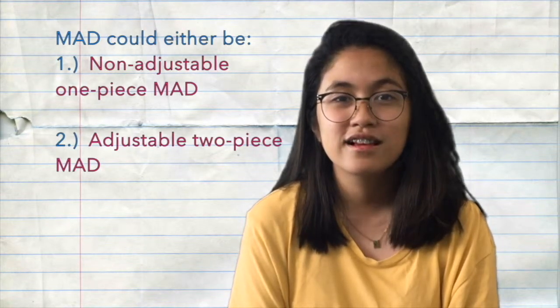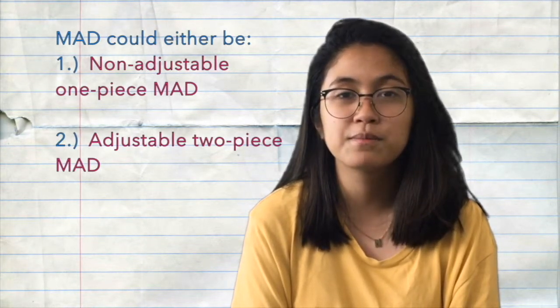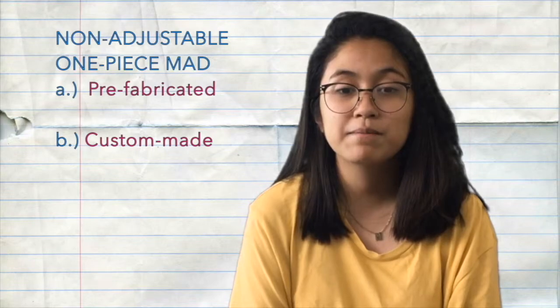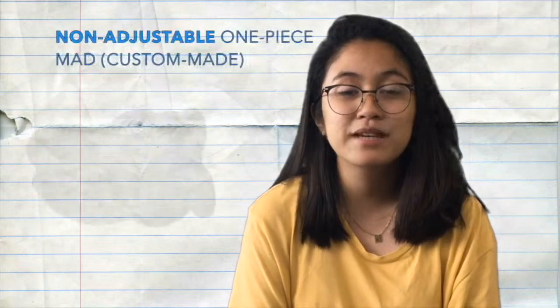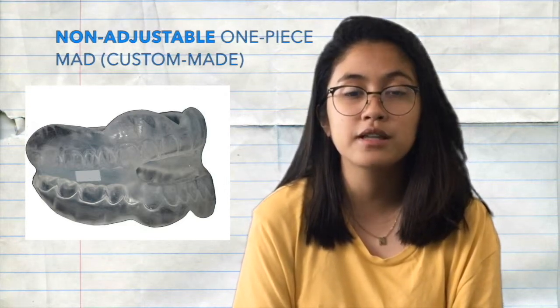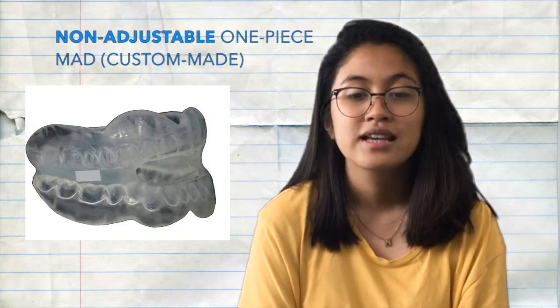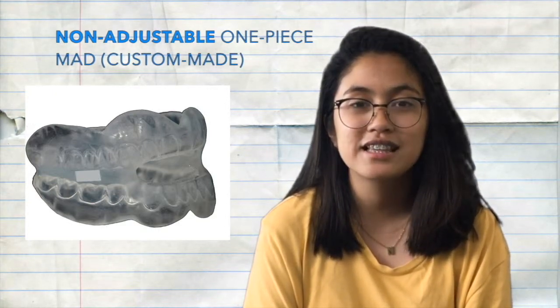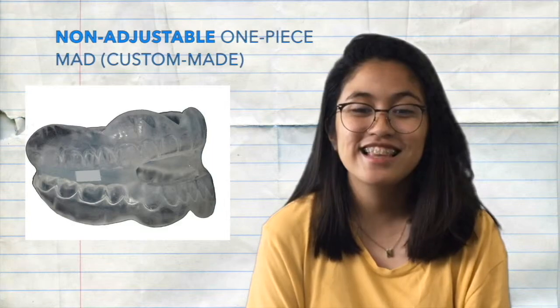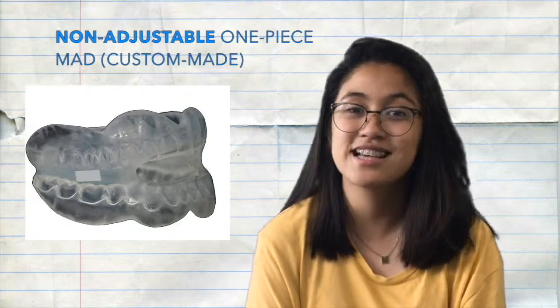So now, let me show you how dentists and dental technicians work together to form an MAD. An MAD could either be a non-adjustable one-piece or an adjustable two-piece MAD. The non-adjustable one-piece could also be either prefabricated or custom-made. The custom-made one-piece is constructed from a thermoplastic material that becomes moldable when warmed by immersion in hot water. The user then takes a mold of their teeth by biting into the softened material, then sends it to cooling. Then, tada! Now you have a custom-made one-piece MAD.